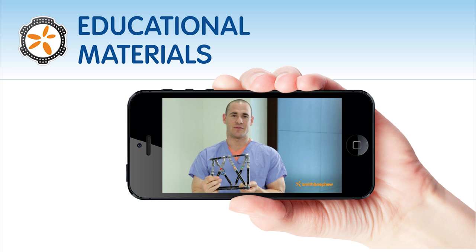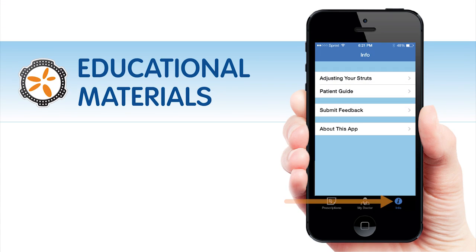Lastly, supplemental educational materials for your patient, including a video to remind patients how to adjust their struts according to their prescription, are located on the Info tab within the iADJUST mobile application.